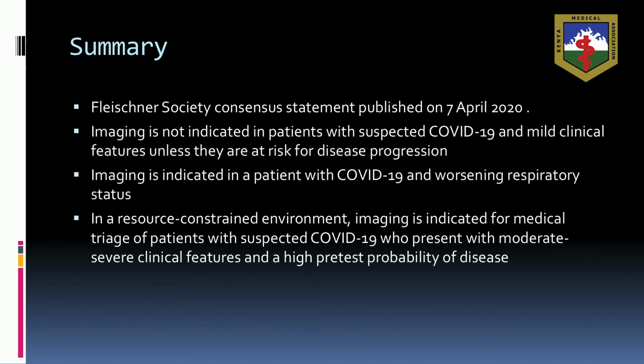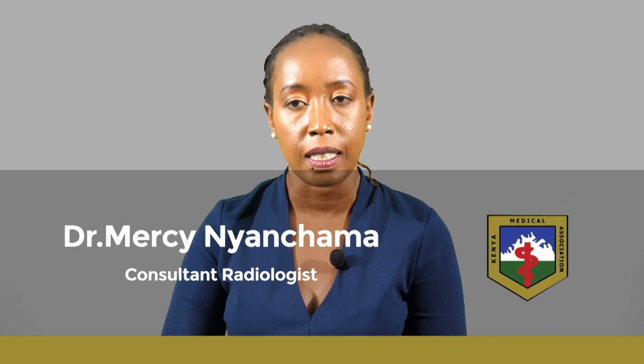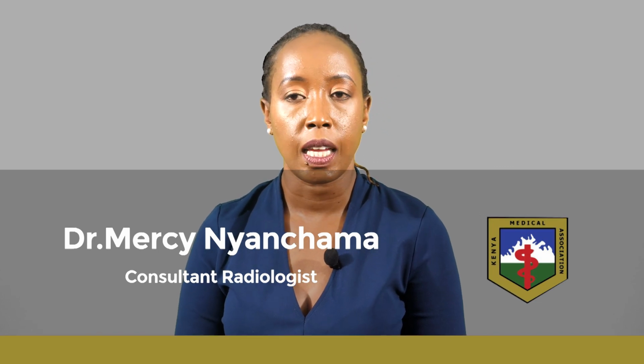In other places where imaging has been used to triage, it's usually if you do not have availability of PCR, so you have to factor in, is the PCR test available, number one. Number two, what is the clinical status of the patient, and is it worsening, all right, or is it stable? So you have to consider this as you choose and as you go ahead. Is imaging useful? Yes, very useful, as we have mentioned.